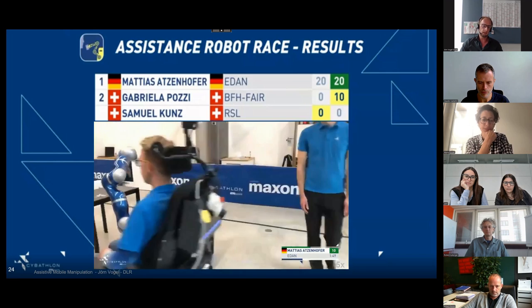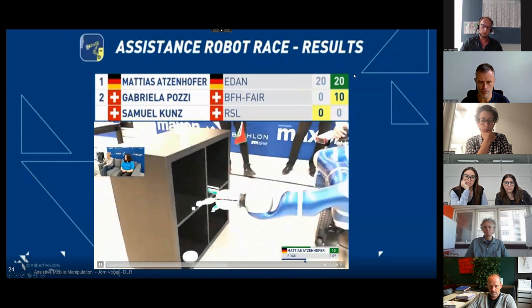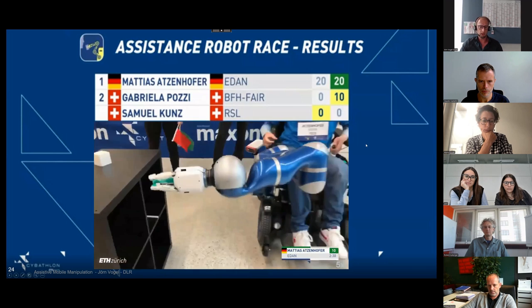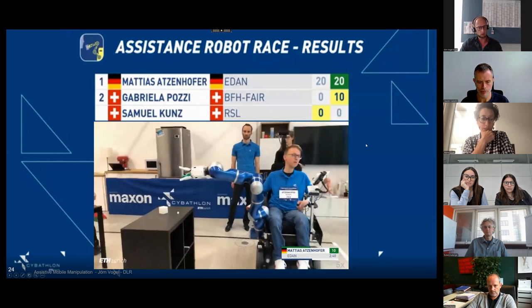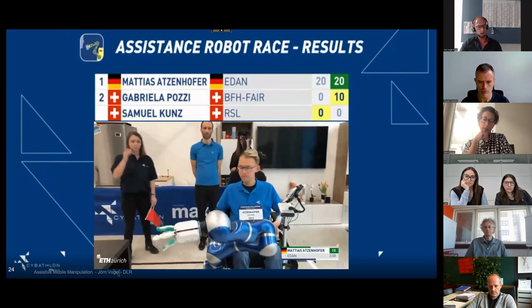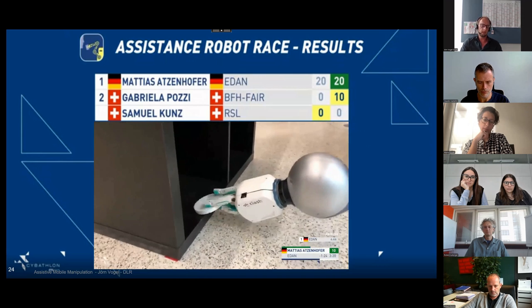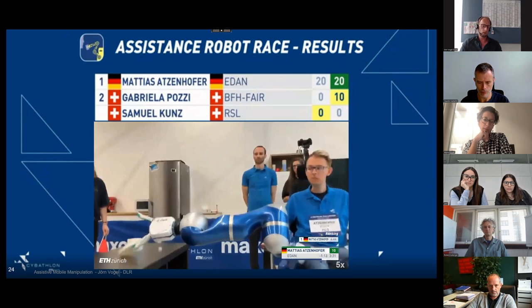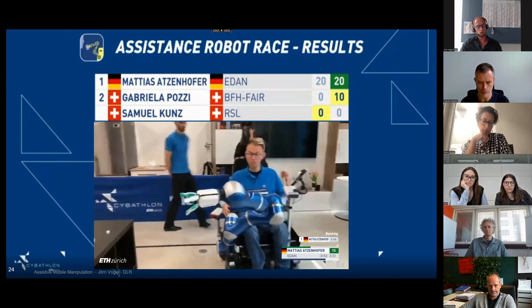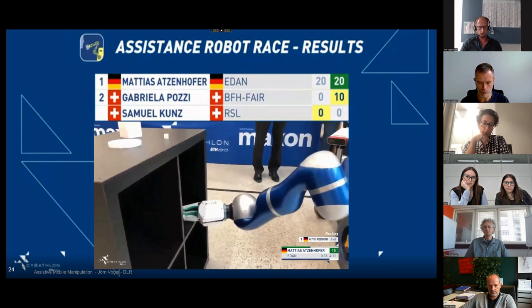And similar on the second task, where you have to empty the shelf, we have a camera here on the side that localizes the objects and also identifies the objects, because we need different strategies for those different kinds of objects. And then knowing which objects Matthias has to retrieve, he just drives the manipulator close to the object, and the strategy that needs to be executed to get a secure grasp on the object is then superimposed on his commands from our shared control approach.